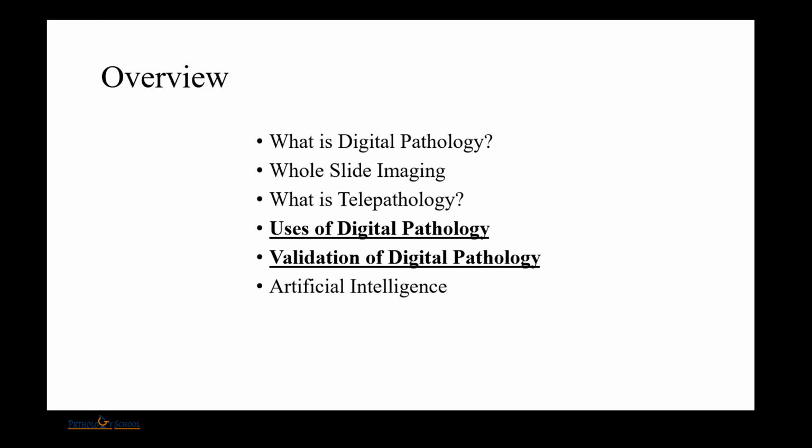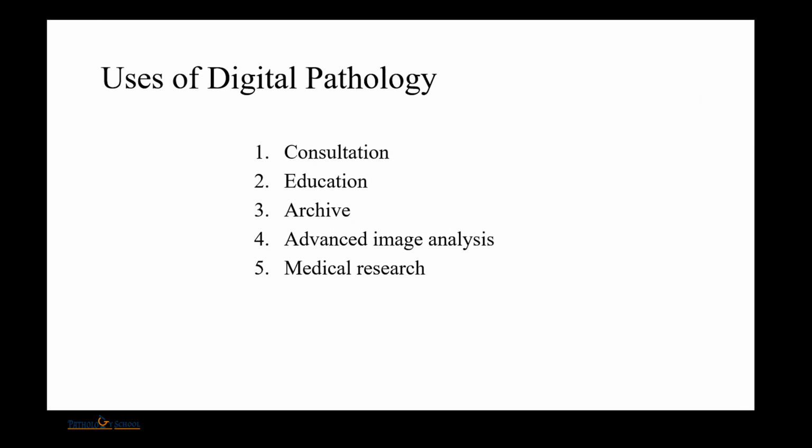Next, we'll be coming up to the uses and validation of digital pathology. Uses: it can be used in consultation, as we discussed, for your daily case reporting. You can use it for your intra-op consultation. You can use it for second opinion, expert opinion. You can also use this, especially in COVID times, for work from home pathology.